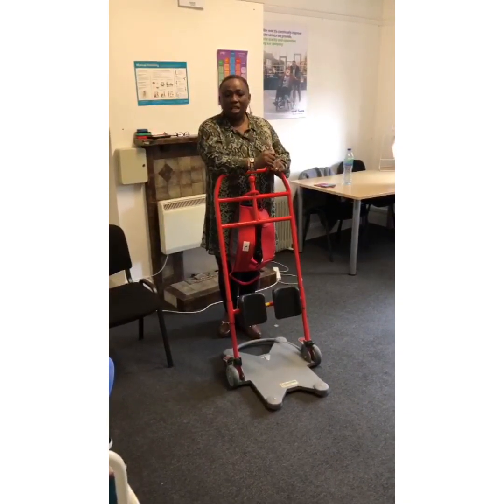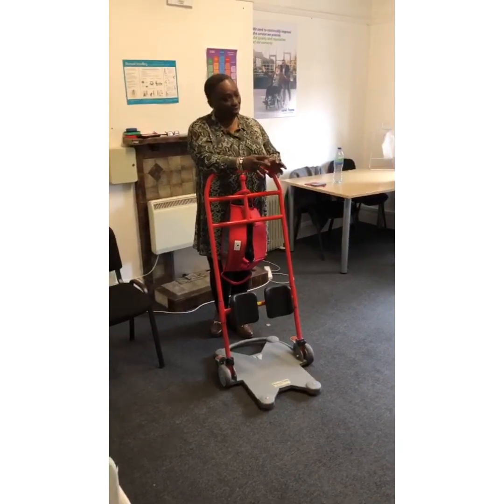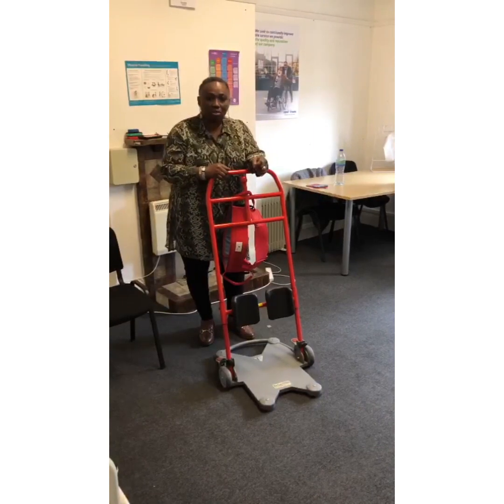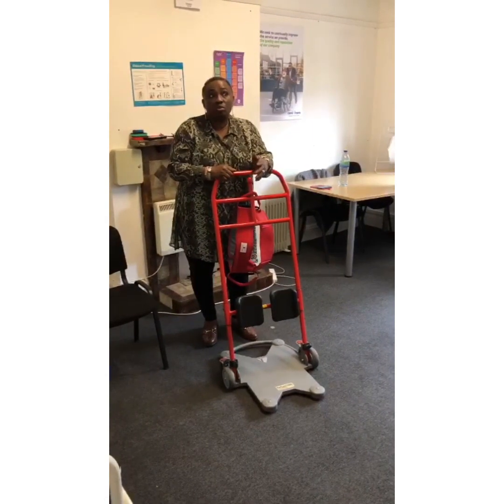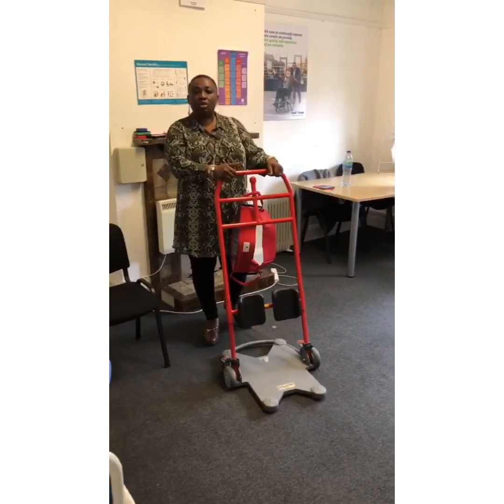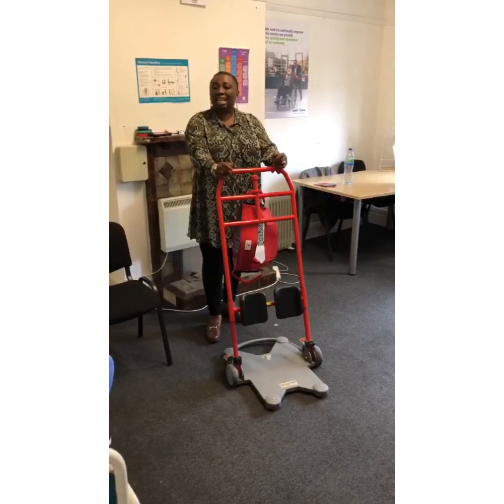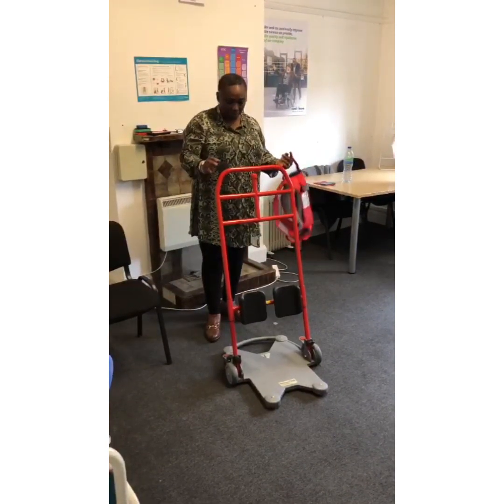Today, like I said, this is a month of manual handling — you asked for the videos, here they come! Now today we're looking at how to use the Rotunda 700 — the 7500. It has to be assessed by the care team, who will tell you how many people are needed to use it, whether it's two carers or one carer.